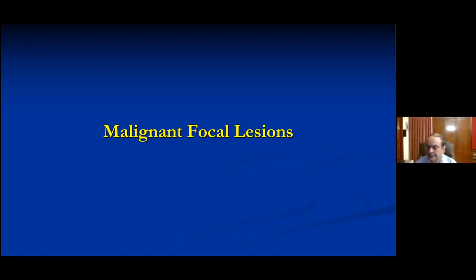So a follow-up question from Anand from Chennai again. He says, you know, sometimes it becomes very difficult to differentiate a dysplastic nodule from typical regenerating nodules. And really, if you have any tips to try and differentiate between the two. So that's absolutely correct. A dysplastic nodule can be very difficult and challenging to distinguish from an early HCC also. Remember, a dysplastic nodule is not T2 bright. Rarely it can show arterial enhancement, but does not show venous washout, right? So a lesion which is T2 dark, shows some subtle arterial enhancement, but no venous washout, is more likely to be a dysplastic nodule.